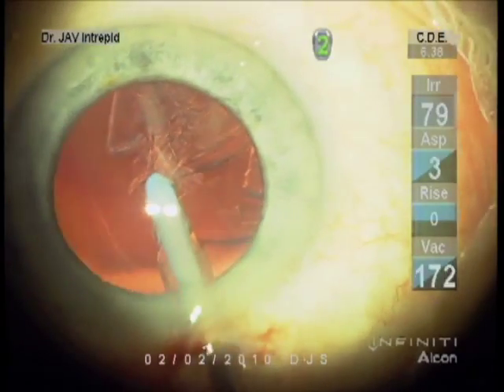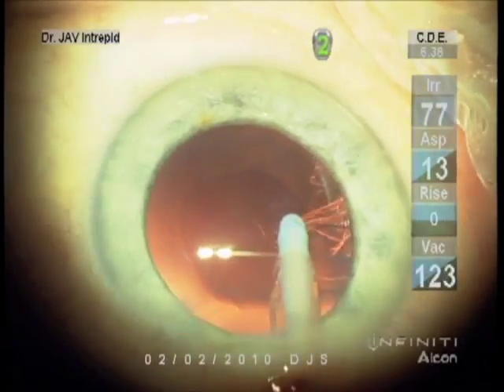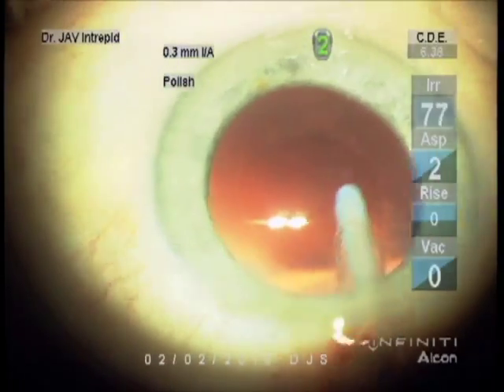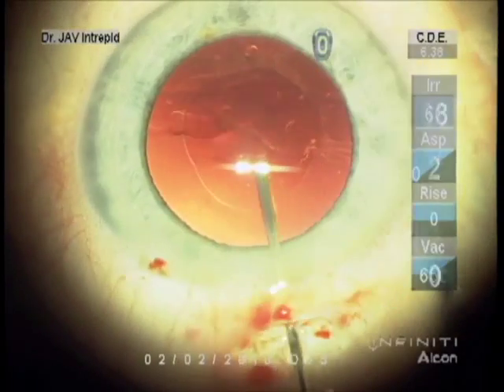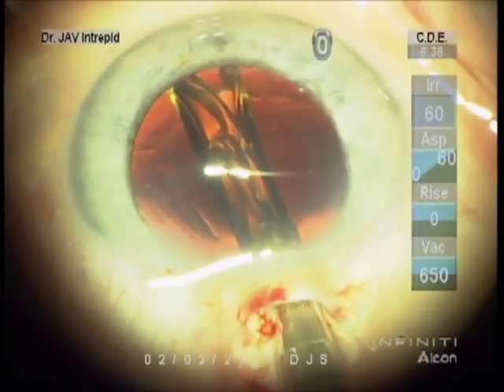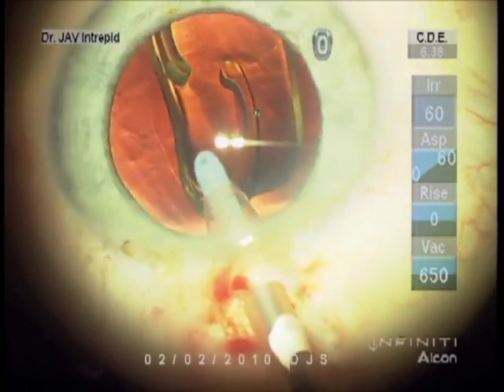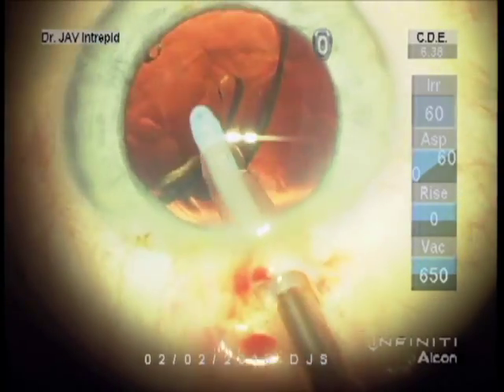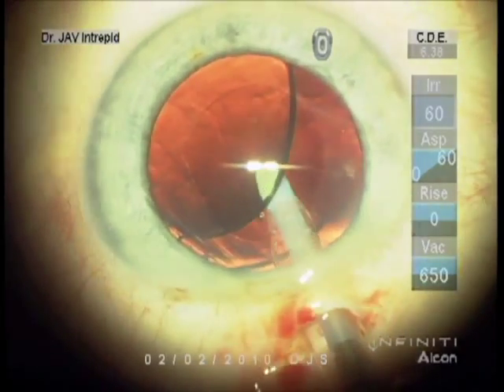I don't need the second instrument anymore. I'm setting it. Using IA with no flow to tuck into place. Rotate into position. The haptic is coming loose — rotating that out properly before dipping underneath.